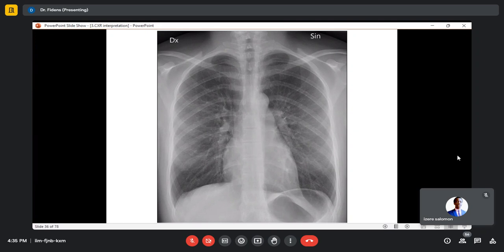Excuse me. Yes, on this second method, where do we check the trachea, like the trachea deviation? In which part that I have not seen? Oh yeah, the trachea.